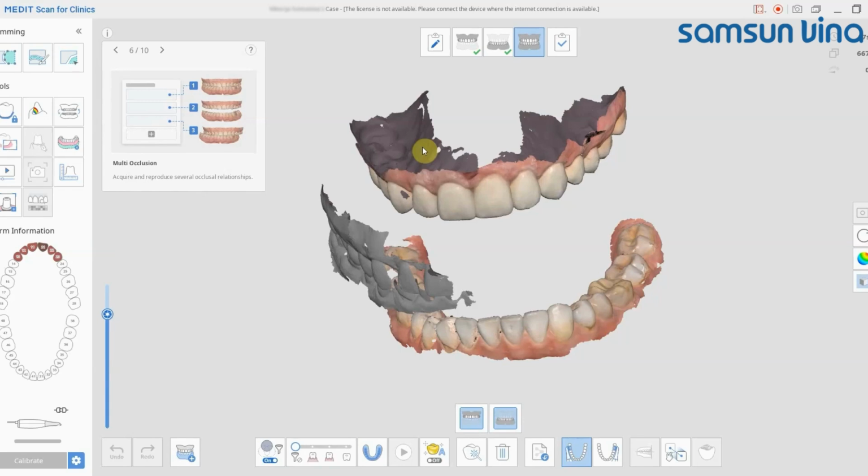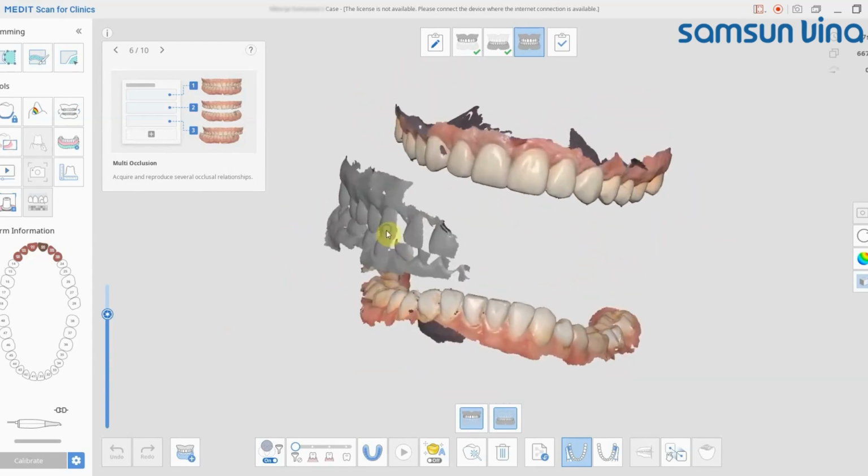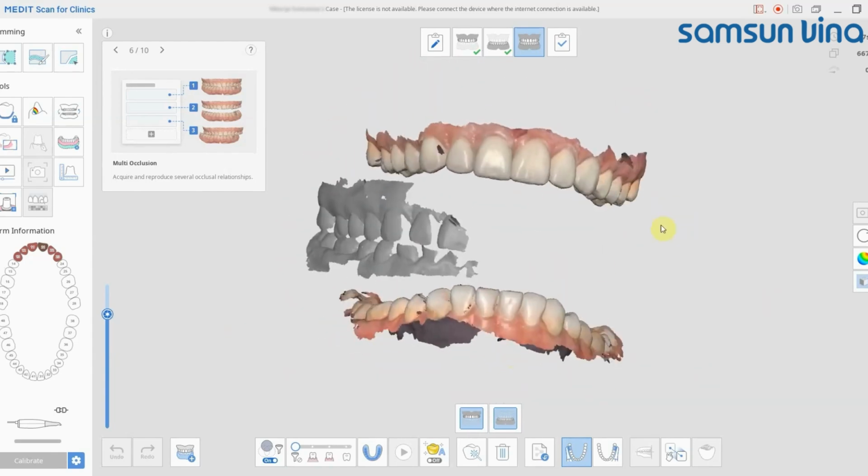and lower scans, I've done the bite scans, and the automatic alignment has failed. What do I do? So the first thing we're going to do is, you can see we've got a bit of a mess here with our scans on screen. So if you ever get into a situation you're not happy, click on this icon down here, manual alignment.